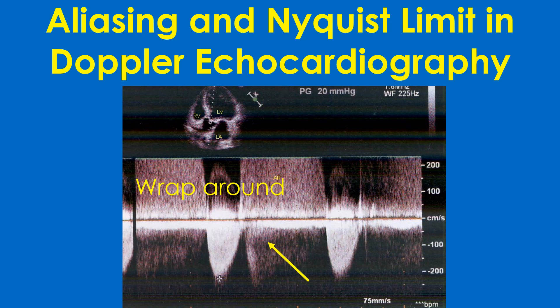The tracing can be depicted upwards to its full extent by adjusting the velocity limit or by shifting the baseline downwards. The dense jet seen below the baseline is the forward aortic flow, and the peak forward gradient is measured as 20 mmHg, which does not indicate significant aortic stenosis.